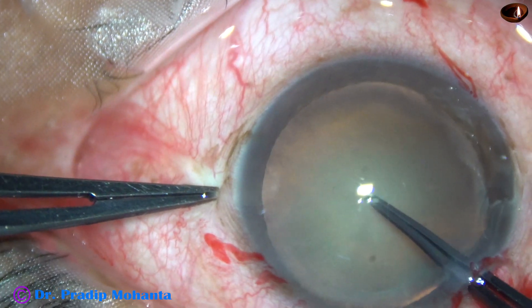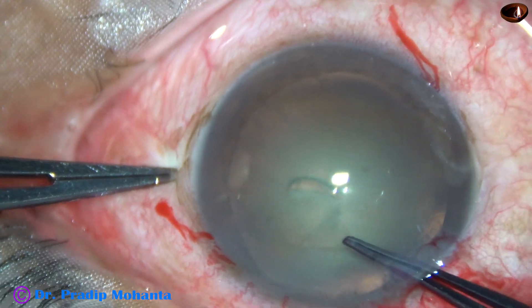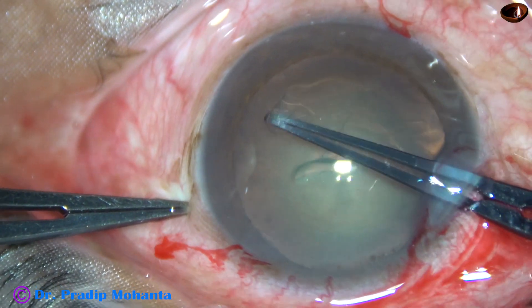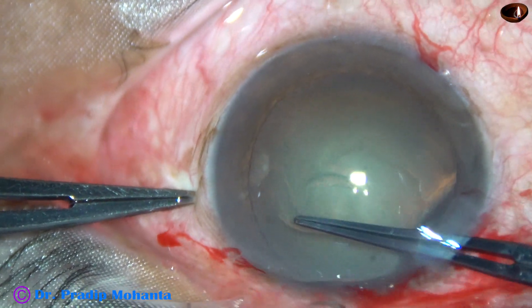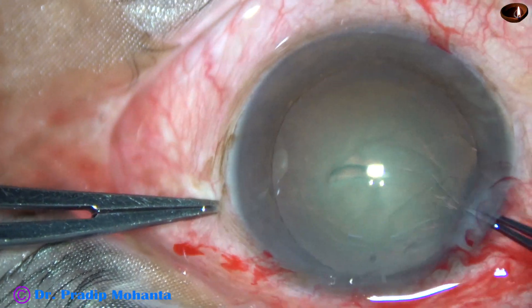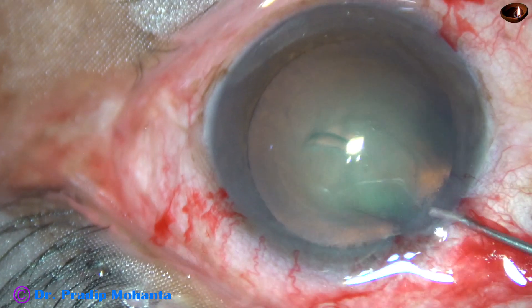Now, capsulorhexis. The anterior capsule is pierced and a capsular tag is raised. This capsular tag is guided all around, and a continuous curvilinear capsulorhexis is done with the help of Utrata forceps. This has been a very satisfactory rhexis of about 5.25 mm.